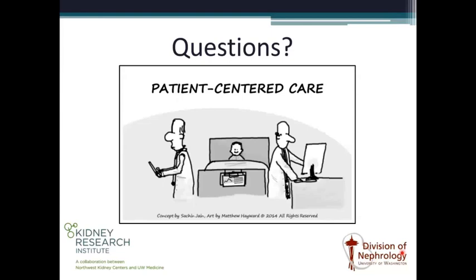Things like that. So are you guys familiar with John Oakley here, neurologist here? So, you know, he does a lot of ABPM in his clinic, even for patients that are not hypertensive, as a part of the workup for dysautonomia along with the tilt table test. So I think there is value there as well. I don't see those patients in my clinic because they're not referred to me usually. John and I do share some patients.